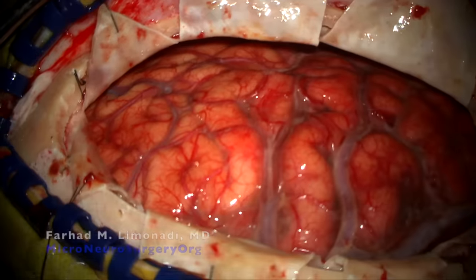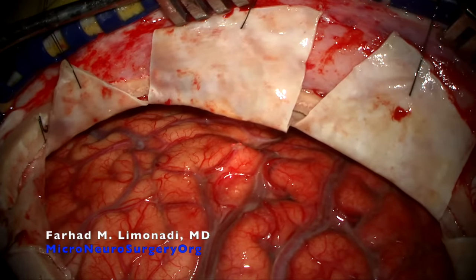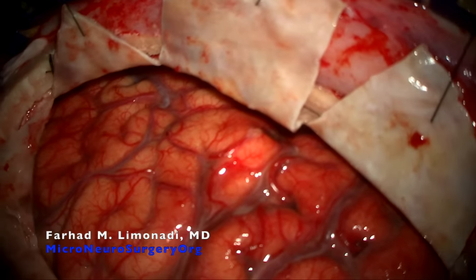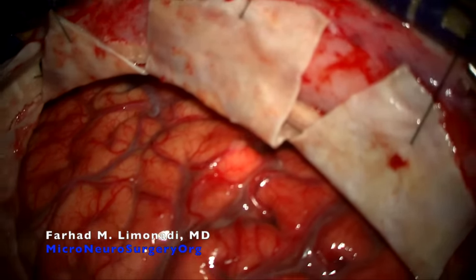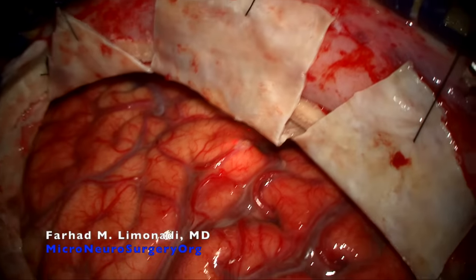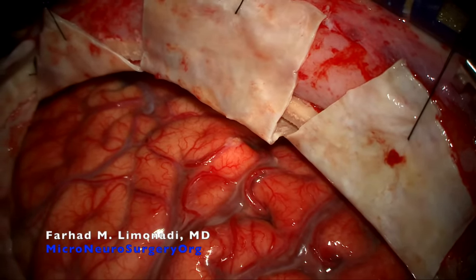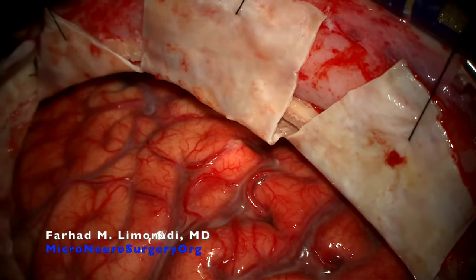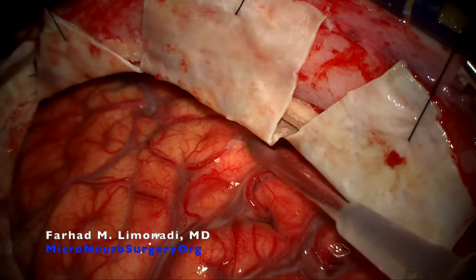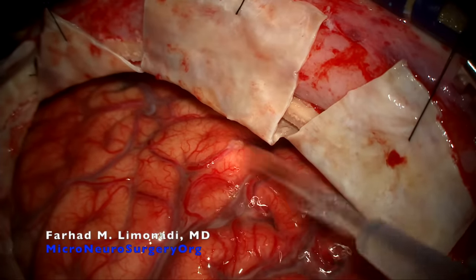The key principles to follow here are: cauterize branches of the middle meningeal artery supplying the dura at the onset. Avoid any direct contact between the surgical instruments and friable brain. Hold bipolar in an angled manner to avoid simultaneous proximity of both tips to the brain, resulting in thermal and electrical injury. Use irrigation for hydrodissection, bipolar for clot morselization, and gentle suction to retrieve formed clots. Avoid mechanical membrane stripping. Instead, cauterize its borders with the dura and gently remove the rest.